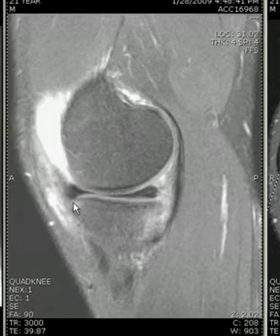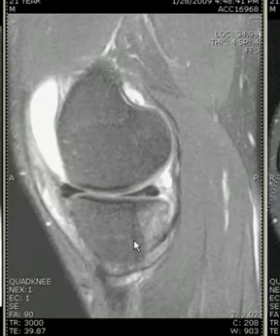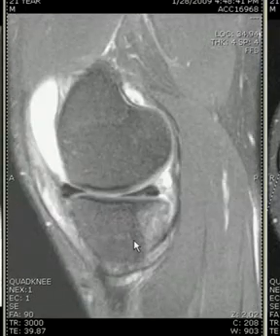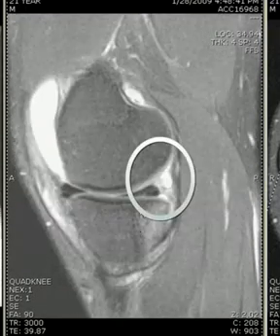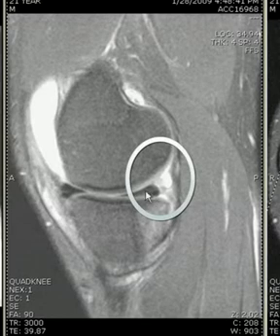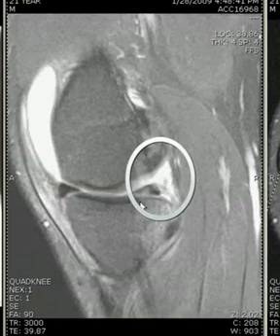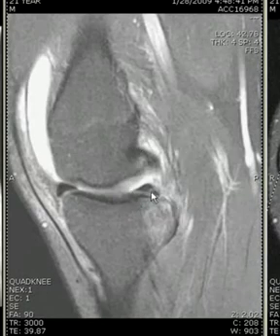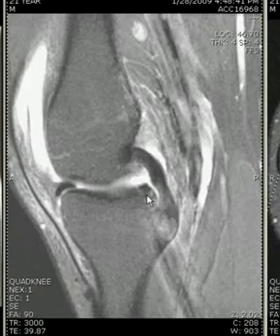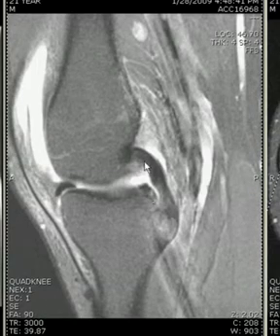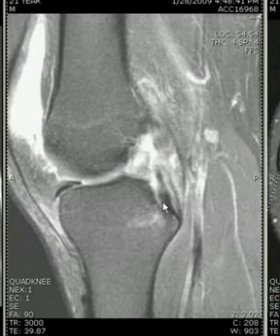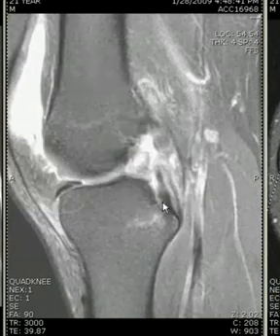As we move more toward the intercondylar notch, we can see high signal within the medial meniscus that touches the inferior free edge, and this extends into the posterior meniscal root as well. The posterior cruciate ligament is intact, but as we move into the anterior cruciate ligament we can see extensive high signal intensity.